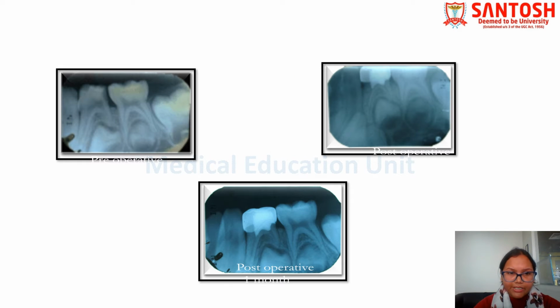This is the radiographic presentation. This is the pre-op radiograph, the first one. The second one is the post-operative radiograph immediately, and the third one is the 1 month follow-up.